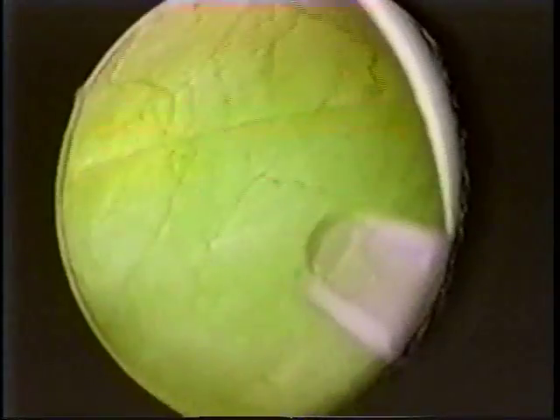Another tumor is located within a bladder diverticulum on the left side of the bladder. If this tumor was being fulgurated with standard electrocautery, there would be a lot of obturator spasm.